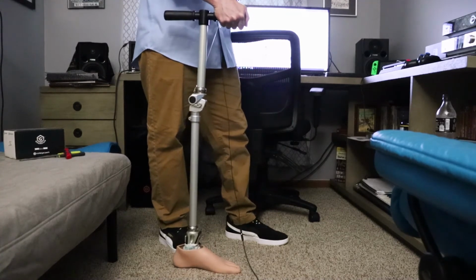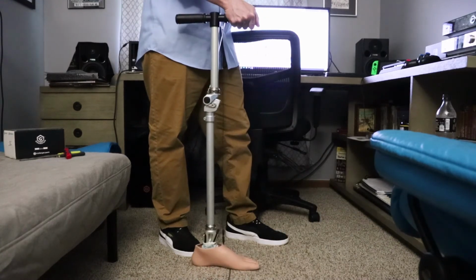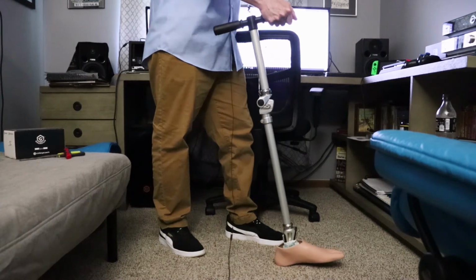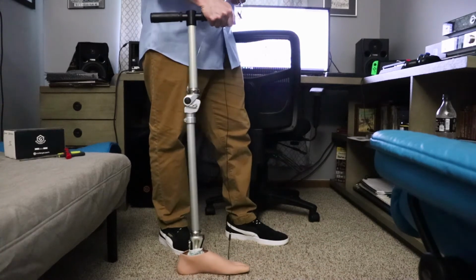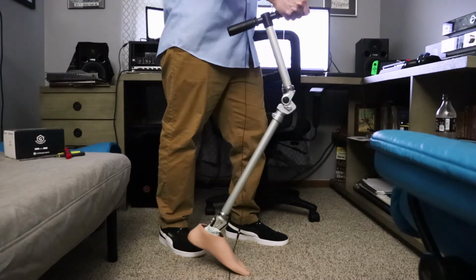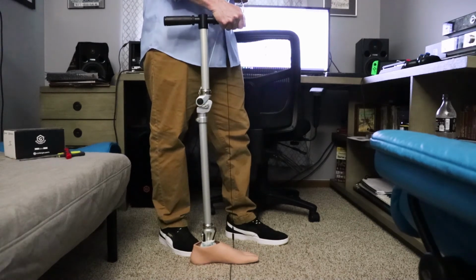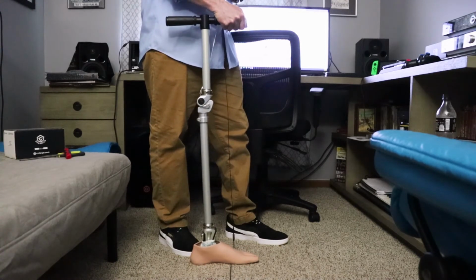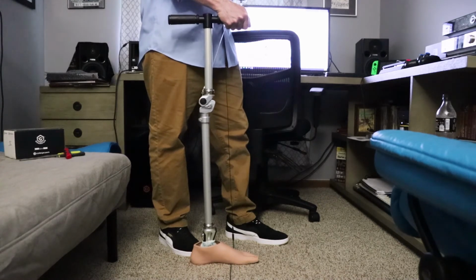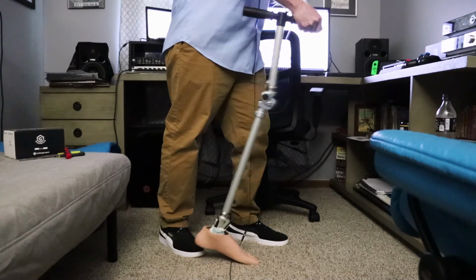Now what I can also do is when I pull up on the lock, if I have an extension moment and just kick the knee forward, it will also unlock then. So I've got the cable pulled up, and now I'm just going to kick the leg forward and it will unlock. And then when there's weight put back on it, it locks again. So weighting the toe is very important. This is just a safety feature. When there's weight, like somebody would be standing on it, we don't want that knee to unlock. We want it to be intentional. So a little weight in the toe and then unlock.